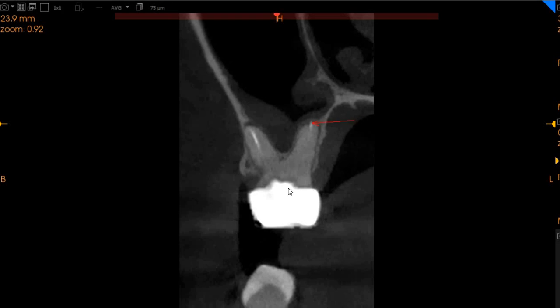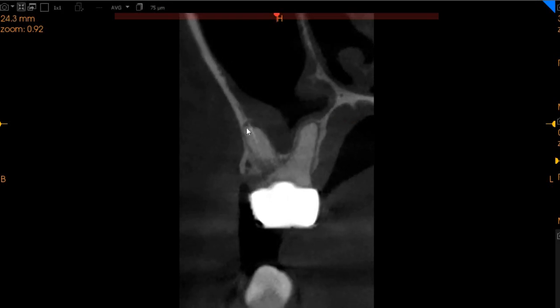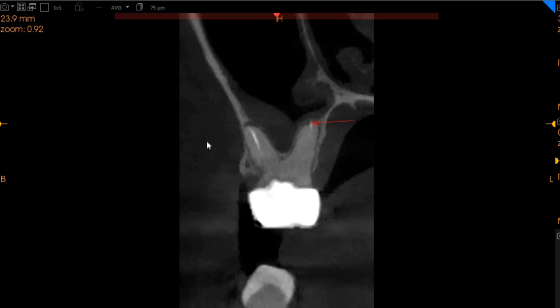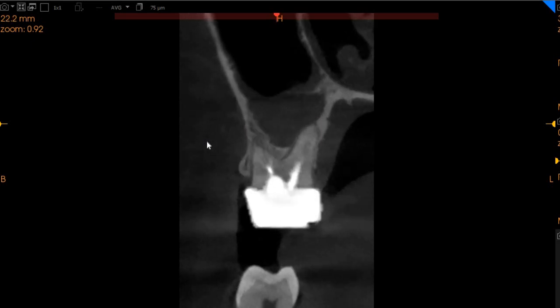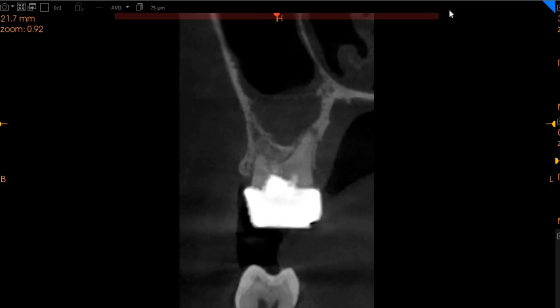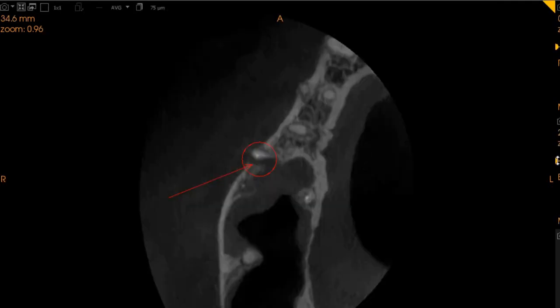The distobuccal route also has an over-obturation here as well. Even though this over-obturation is quite slight, it is associated with a very mild apical radiolucency. We don't see any cracks in this tooth at this moment.